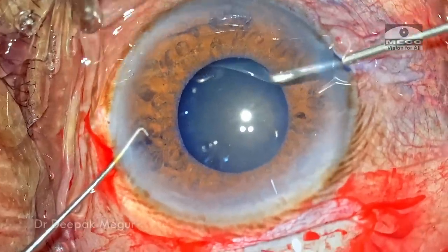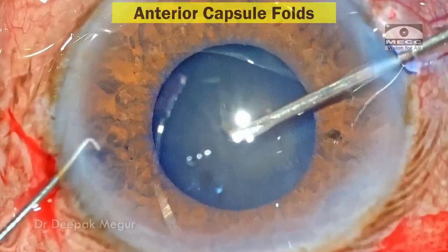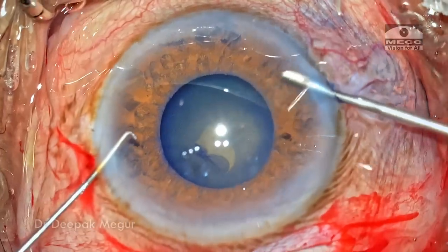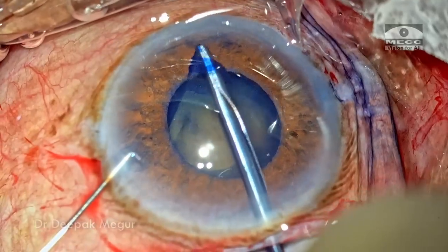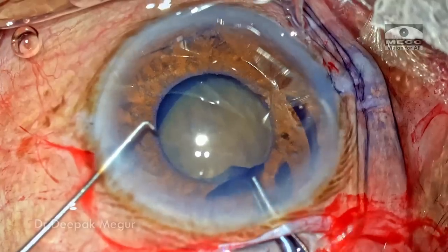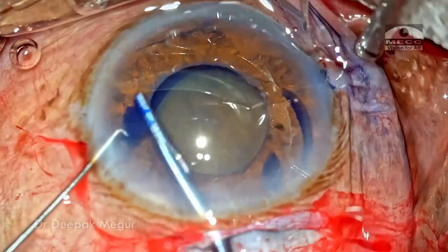As I puncture the anterior capsule with a needle, we can see that there are multiple radial folds arising at the anterior capsule, suggesting the laxity of the zonules. The flap is raised and the needle is changed with the forceps, and using the forceps I'm trying to create a rhexis. Eventually I have a plan to sacrifice the bag — the rhexis is not large enough, but I'm not overtly concerned about it since I'm planning to sacrifice and remove the bag.